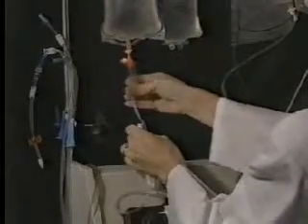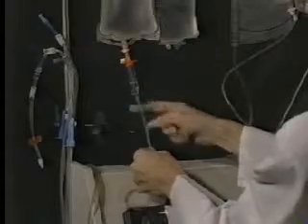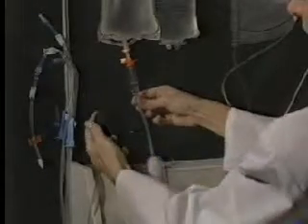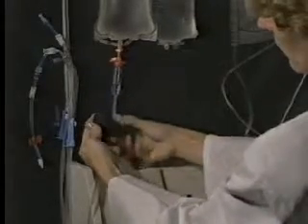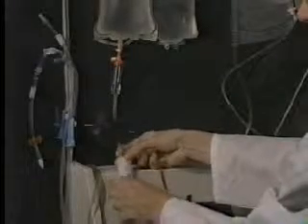Fill the drip chamber 1/2 full. Then place the AC line in the AC level detector. Ensure that the AC line is not kinked. The filter should be below the AC level detector.